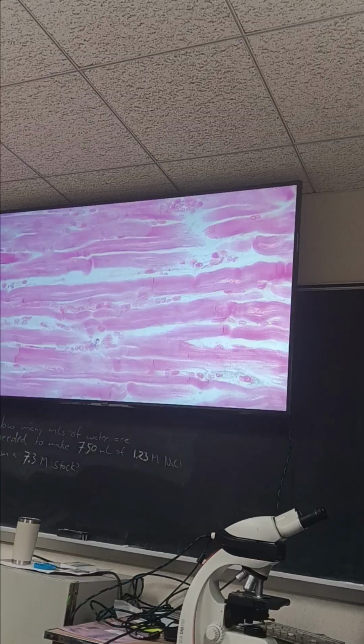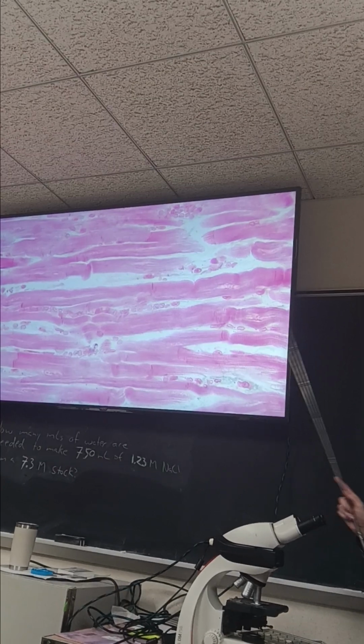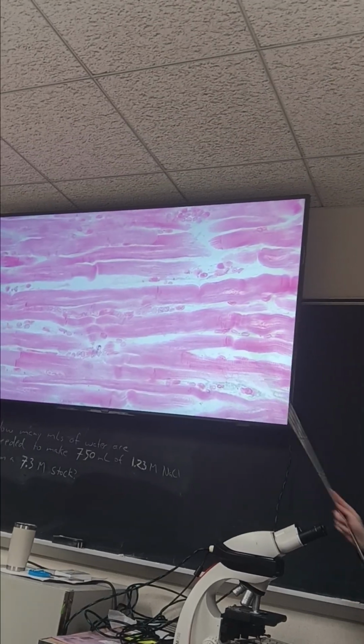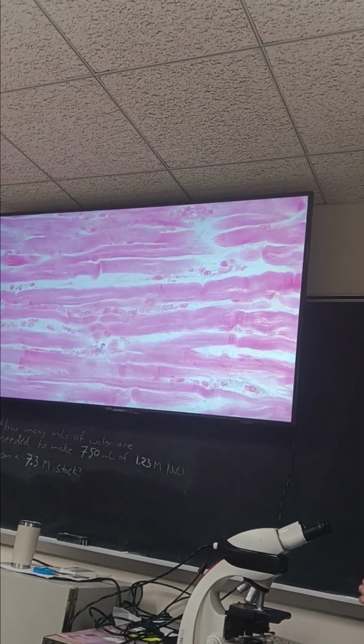So what else do you see maybe? Okay, so here's like the best example of branch that I've seen, honestly. So I wouldn't lean on that too much, the idea of being able to see clear branchings, but also yes, this cell branches right here, very clearly, and that is a cardiac muscle thing. So if we do get lucky on the practical or whenever you're making your drawings and you see that pattern, absolutely think of that as a major feature.